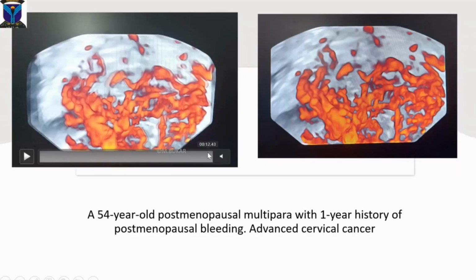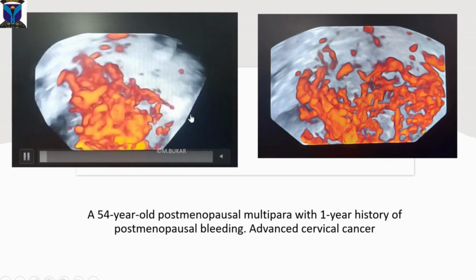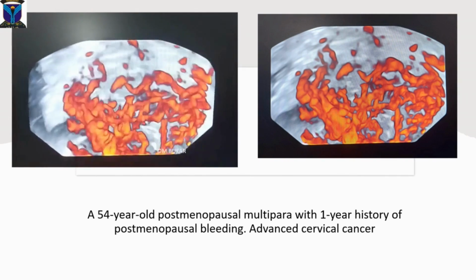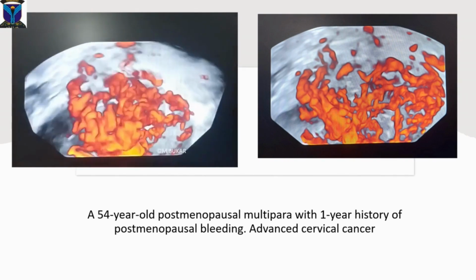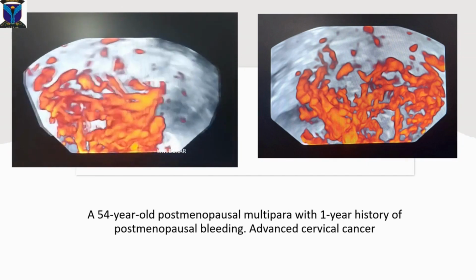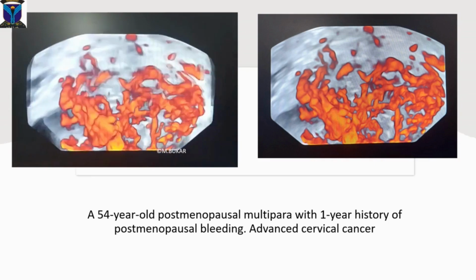This was a case of advanced cancer of the cervix. You can see on this still image, look at this density of vessels. Look at all these features described of malignancy. And look at the single loop, clearly in 360 degrees, showing all features of a malignant vascular lesion.